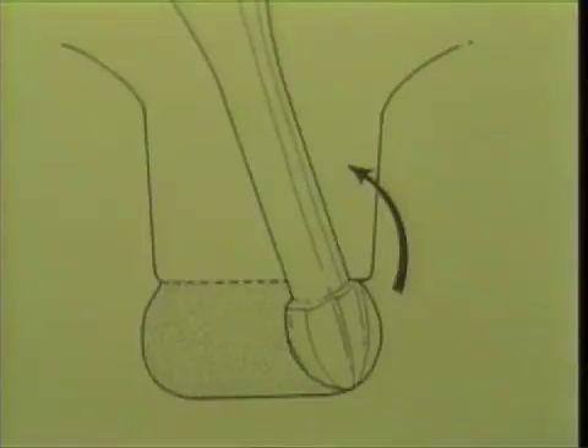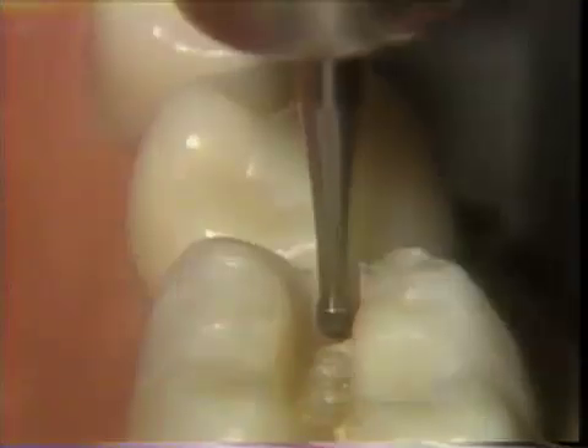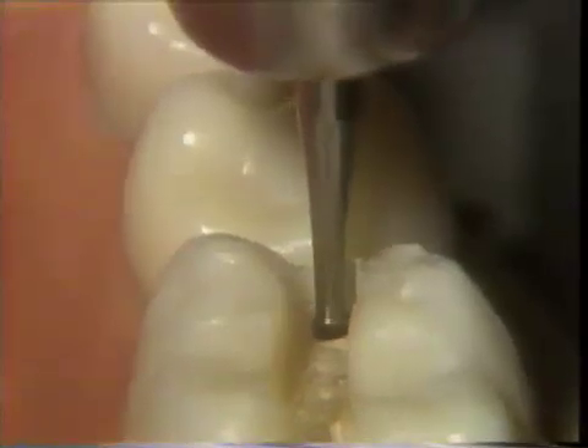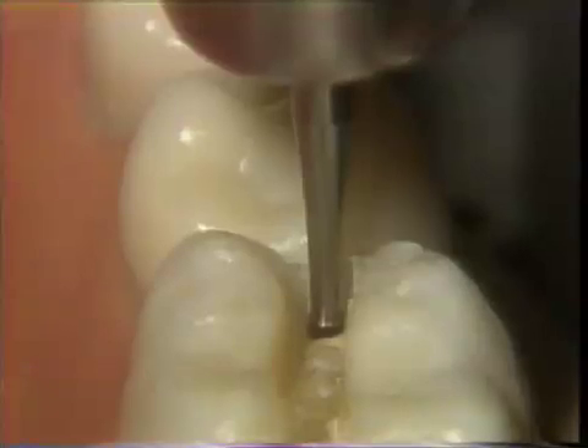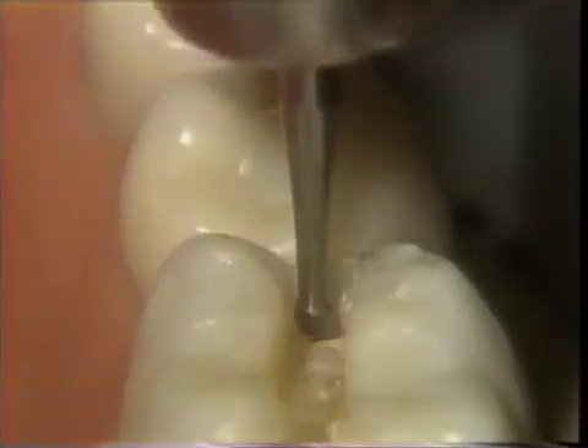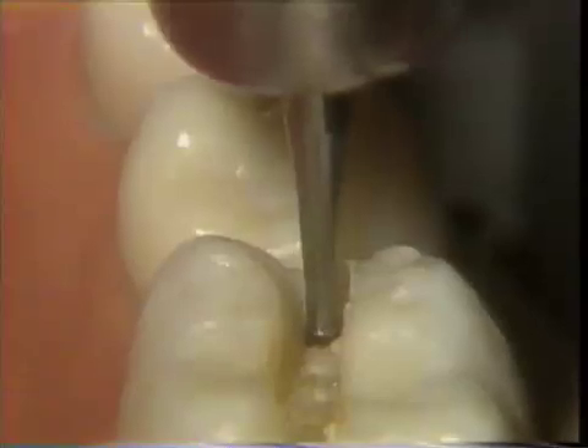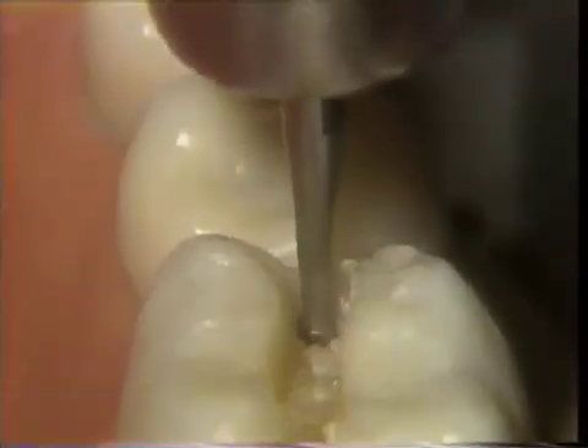The diagrammatic example will now be demonstrated on the extracted tooth. The dento-enamel junction is identified, and penetration of the burr one-quarter in dentin and three-quarters in enamel is begun. As mentioned in the diagrammatic example, three or four strokings of the burr toward the cervical usually results in the burr penetrating to one-quarter millimeter beyond its cutting area.